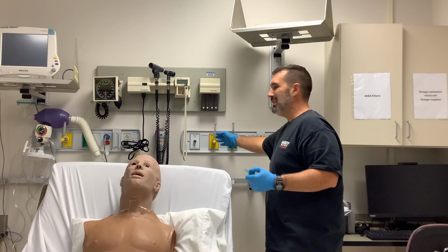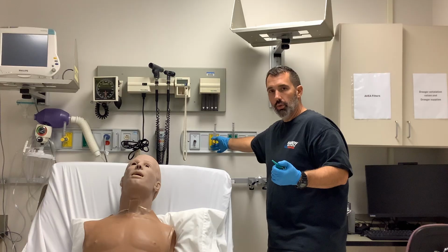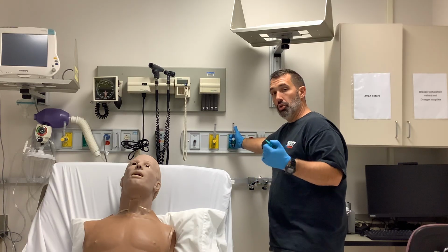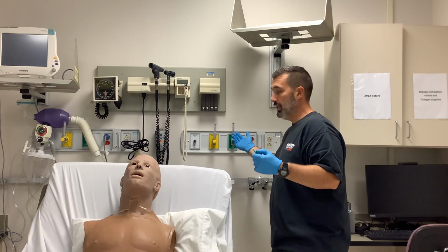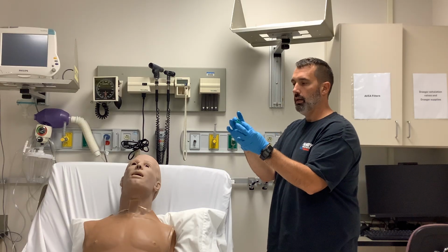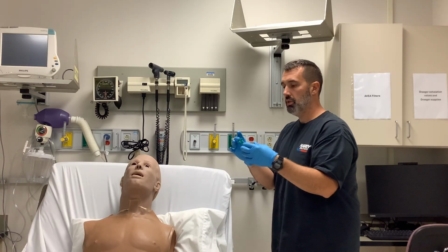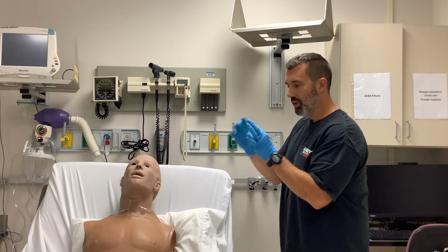The medical air outlet, typically in the United States, should say medical air on it, but it should also be yellow in color. The medical oxygen outlet should say medical grade oxygen and be green in color here in the United States. Notice I'm holding these little barbed adapters, these little Christmas tree adapters. These may come in different colors as well, so you may see yellow ones. You could potentially see clear ones. The hospitals that I've worked at have gone to clear ones.